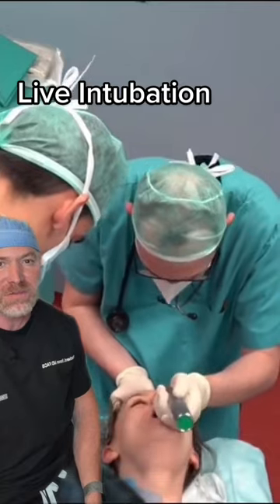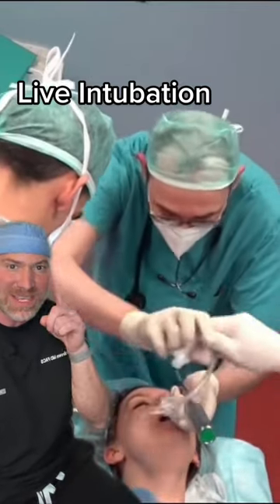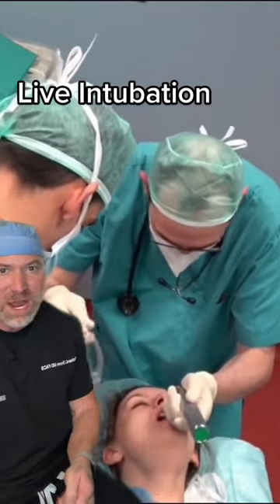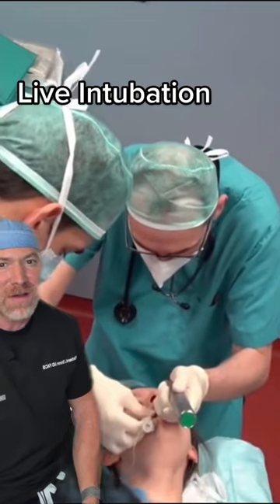He's gonna put the laryngoscope in now and he's visualizing the vocal cords. Now the person to hand that tube over should be this guy right here — he should just give it right to him, to his right hand, so he doesn't have to pause. But everything went great, it's totally fine.